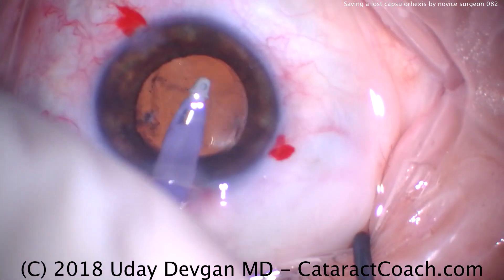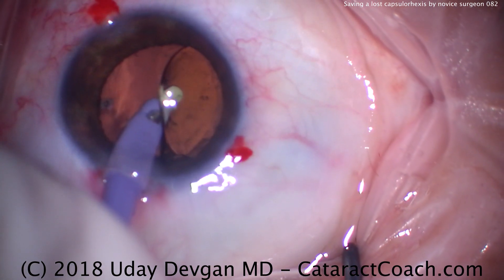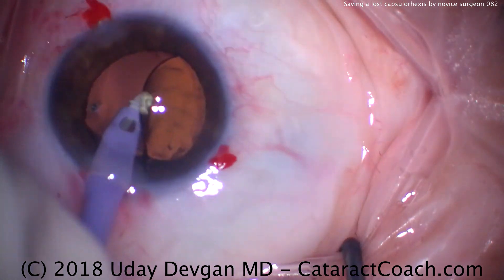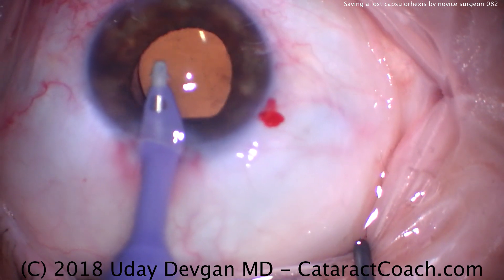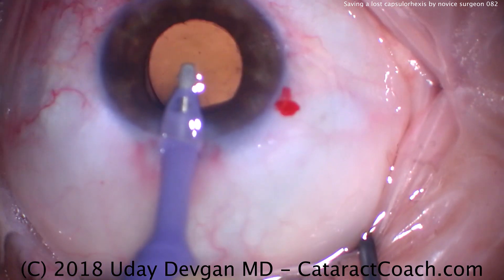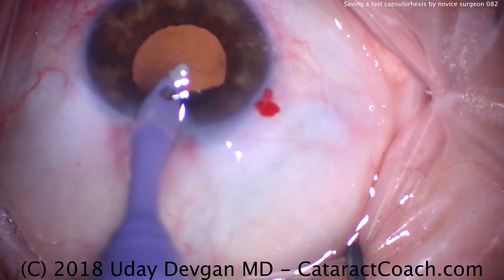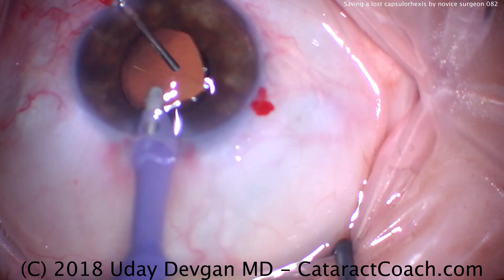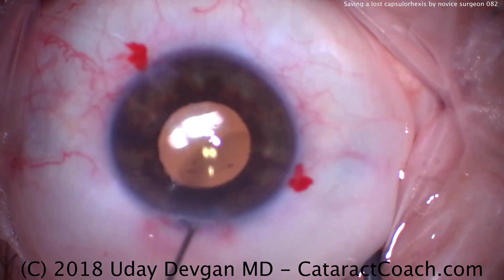I wanted to show you this video because if you start off and have some sort of irregular or small capsulorhexis and you're not sure what to do, you can just make a new rexis larger than the first pre-existing one and encompass it so that any irregularities are taken out of the picture. Like in this case, we now have a nice, round, generous, intact, curvilinear capsulorhexis and the patient will have a fantastic visual outcome.